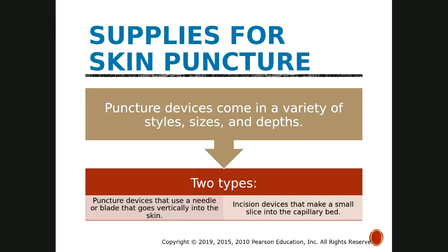So, supplies for skin puncture. Puncture devices come in a variety of styles, sizes, and depths. There are puncture devices that use a needle or blade that goes vertically into the skin, and incision devices that make a small slice into the capillary bed.